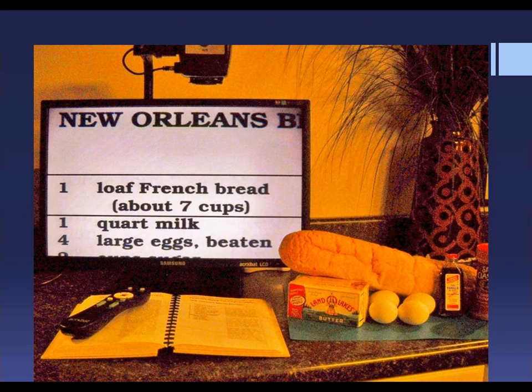The next slide has to do with reading your cookbooks and recipes. Have you struggled with reading your recipes and trying to stay on task with ingredients? This is the Acrobat LCD again, moved from the side of the stove to the countertop. With the camera in reading mode, we can magnify the recipe to whatever level you need for easy reading. Notice the line markers around the very first ingredient — they help you stay on task as you move down the recipe and into the instructions. Line markers and other special options including freeze frames and assorted background colors are available through the remote control.